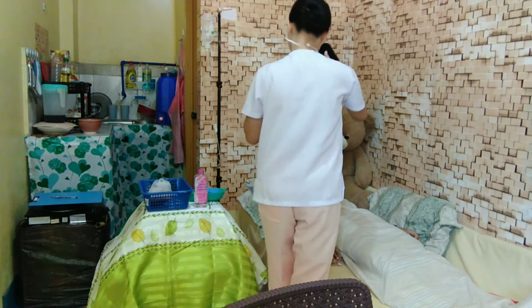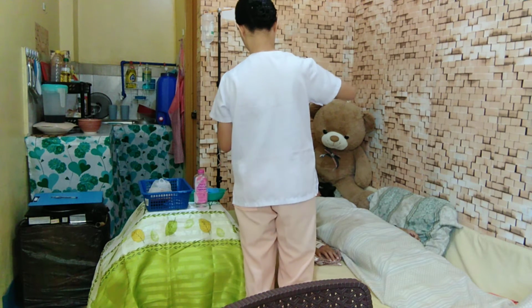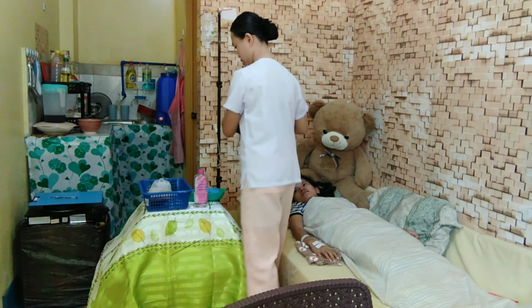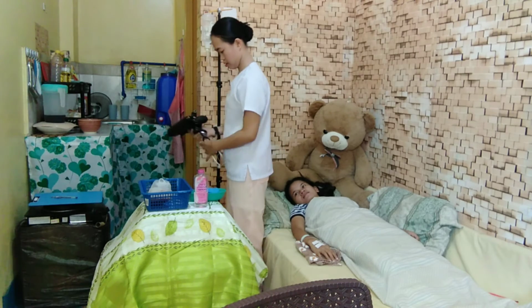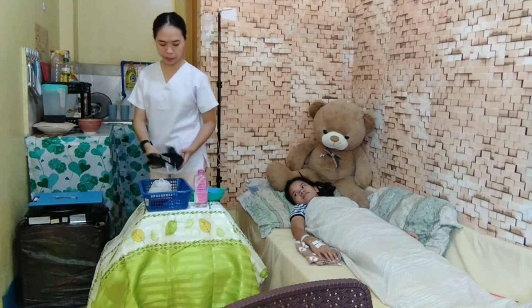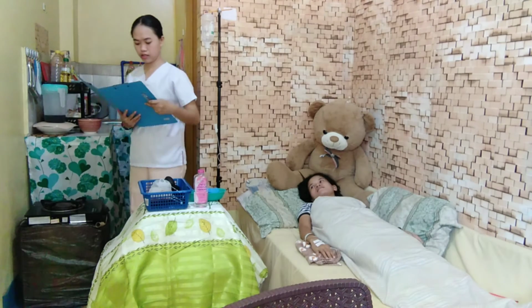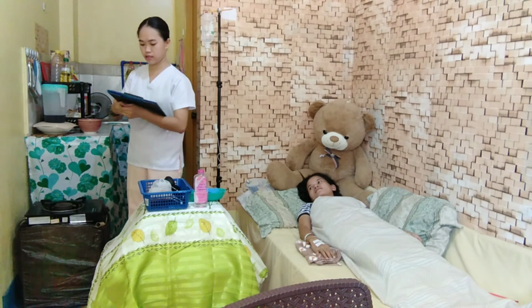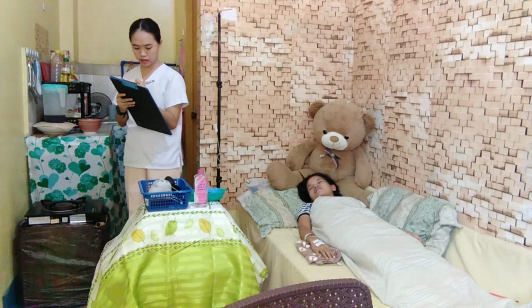Thank you, ma'am. After taking the blood pressure, I will now record it on the record sheet. Vital signs: 100.